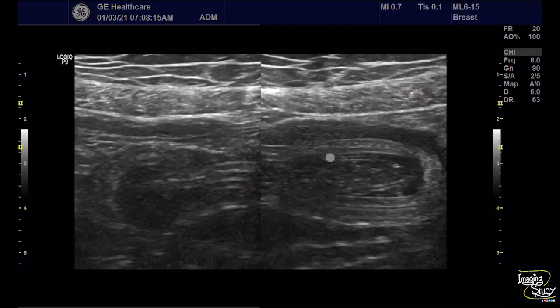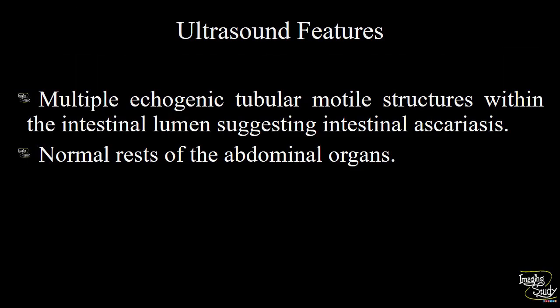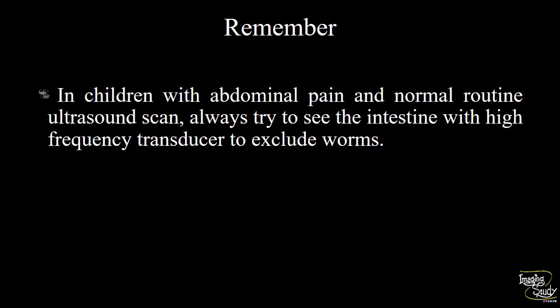Here are the worms within the intestinal lumen. They may occlude the lumen — if they do, the patient will present with features of intestinal obstruction. In summary: multiple echogenic tubular motile structures noted within the intestinal lumen suggesting intestinal ascariasis. The rest of the abdominal organs were normal.